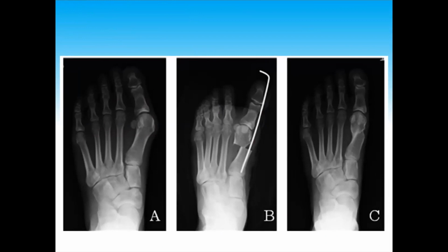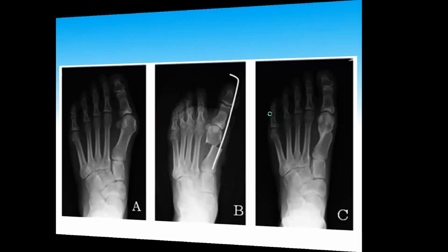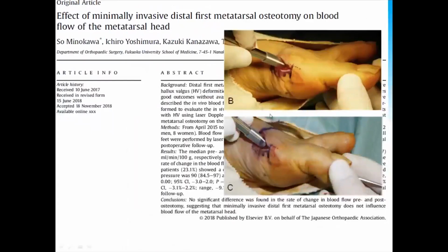And this was a 4 to 6 week recovery, but with every step postoperatively, the pin would move, get draining, and could create some pain and swelling issues because it's unstable, and also the pin is prominent. So there have even been reports of osteomyelitis after this kind of pinning procedure.